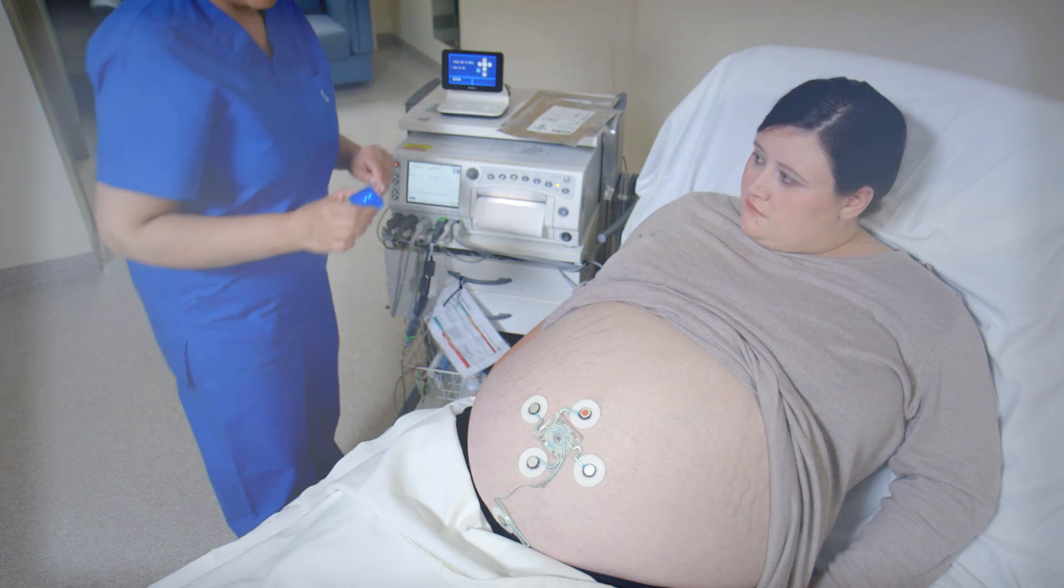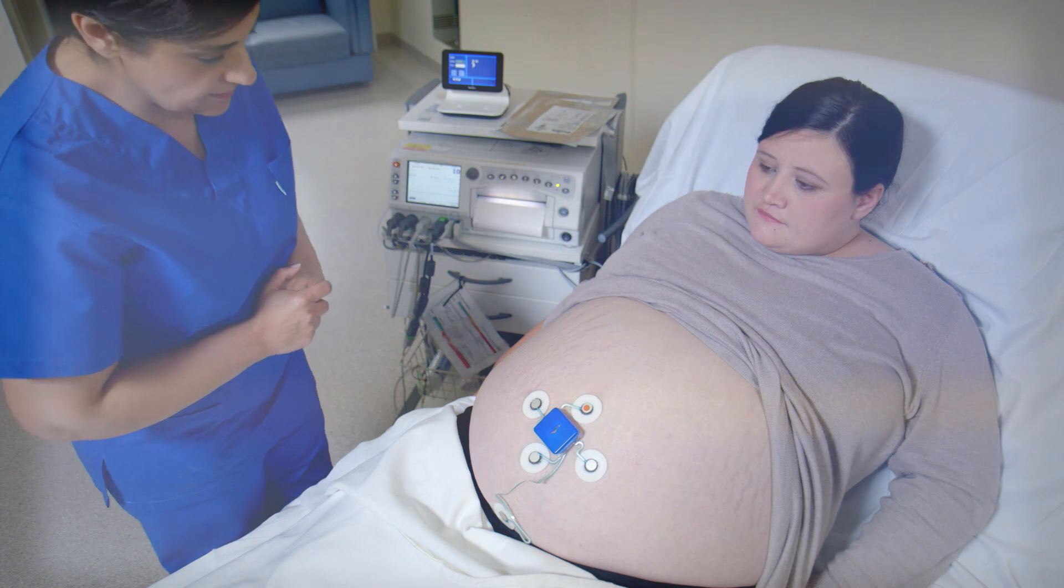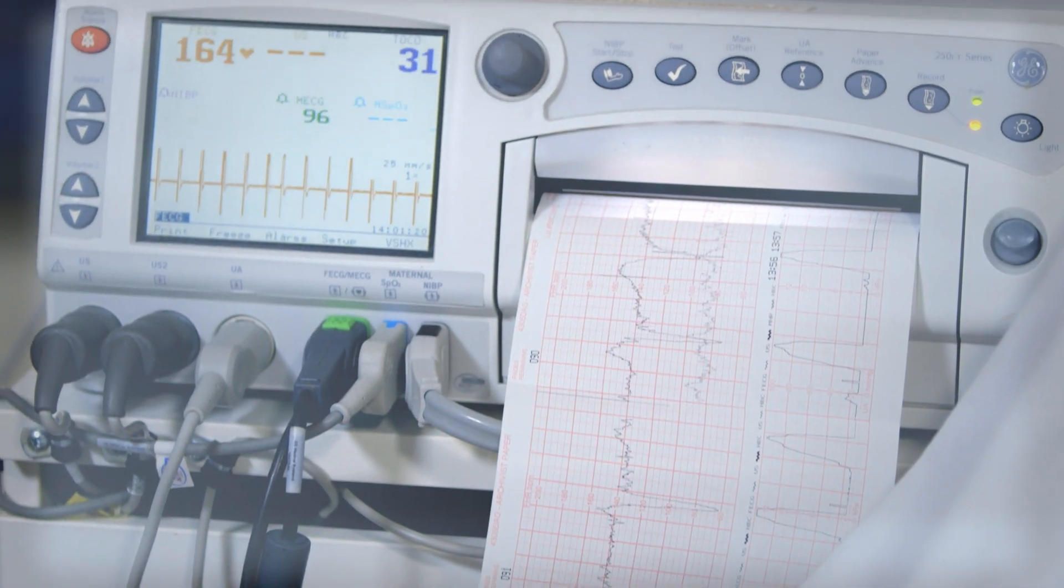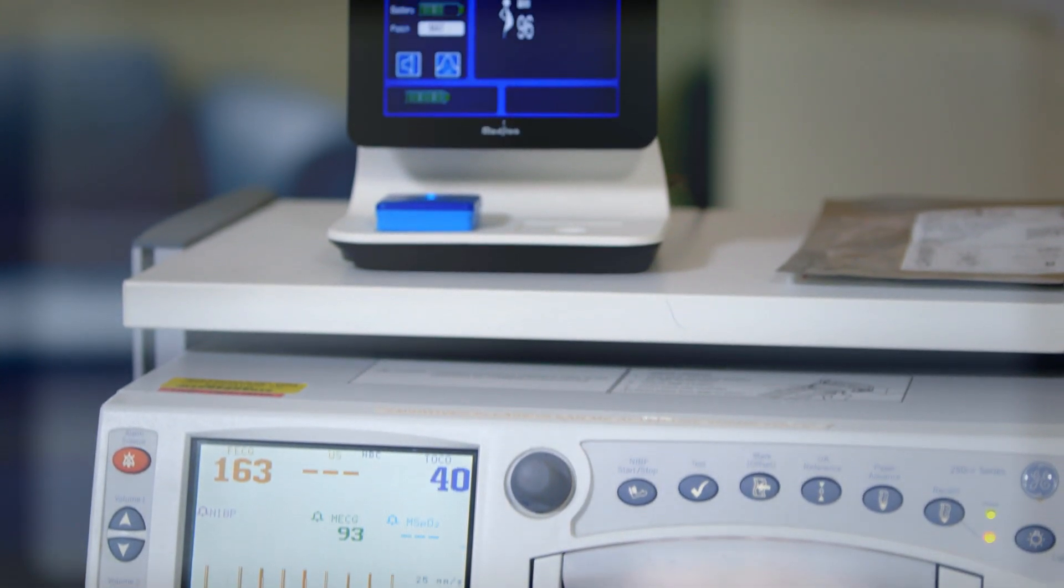The Novi pod communicates using Bluetooth with the interface, and the trace data flows seamlessly from the pod to the interface, to the monitor, and then onto your central station and archiving solution.